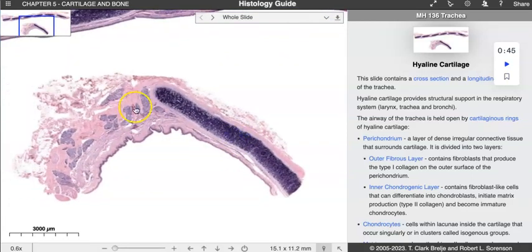And so as we're zooming in, try to keep your bearings, right? What is the outer peripheral surface of the trachea and what is the tracheal lining? This is the area where air would essentially be flowing through. You can also start to see color differences, and you can see the lining of the trachea. So this darker purple line here is going to be that pseudostratified ciliated columnar lining that you guys looked at before. You also have a little bit of connective tissue in here.